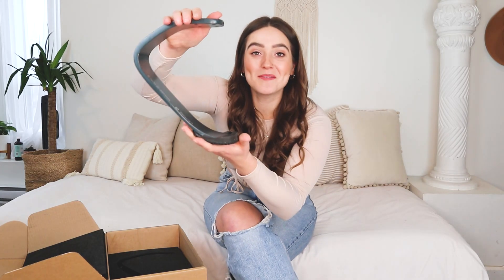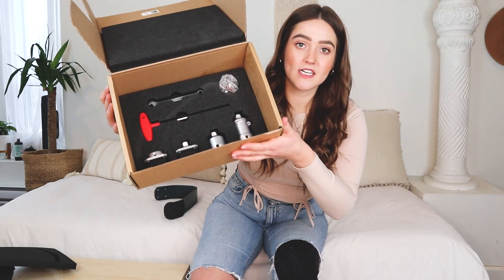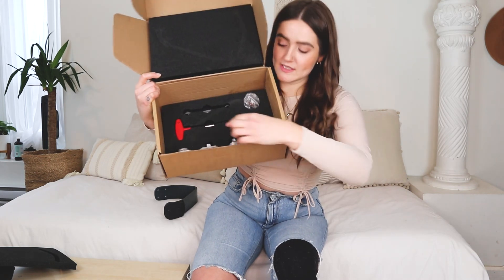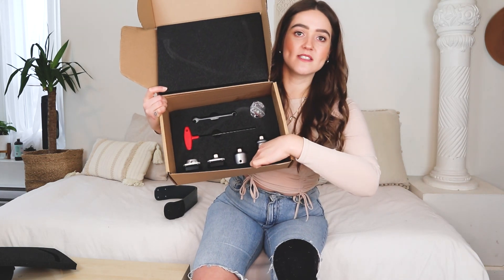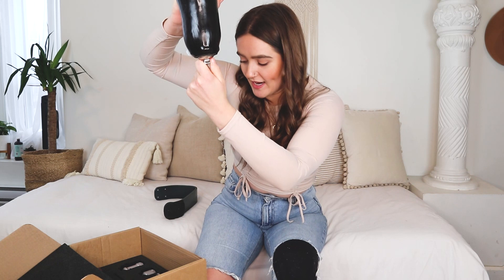Look at this blade — she is a beaut! This is everything else that comes in the box: a wrench, a screwdriver, all your screws, and then all the different attachments depending on how long you need to make your prosthetic leg.